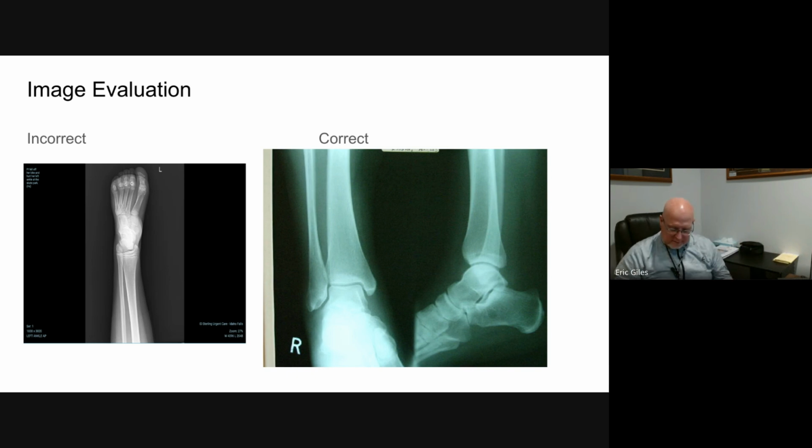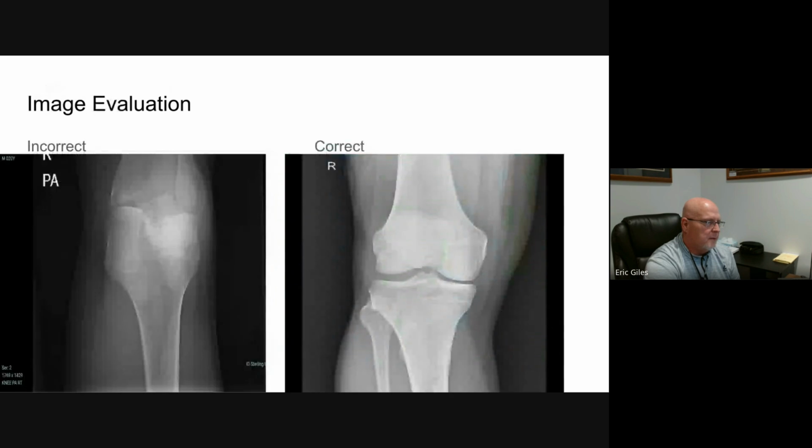And we know that the little bone, the fibula, is on the outside of our leg, and the tibia is on the inside of our leg. So we look down at our leg, or we look at our skeleton guy, his fibula is on the outside where his tibia is on the inside, and that is his right ankle. Yeah, I hope that makes sense to you guys. Just make sure things are hung correctly.